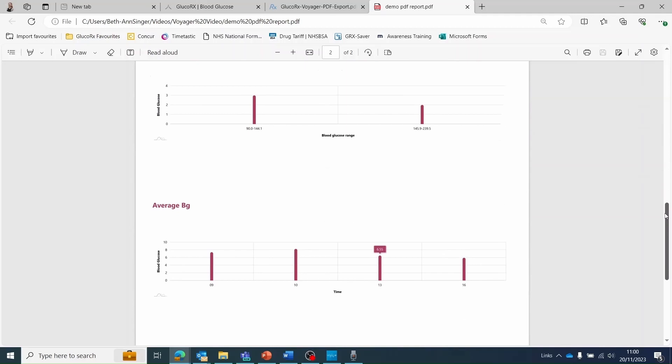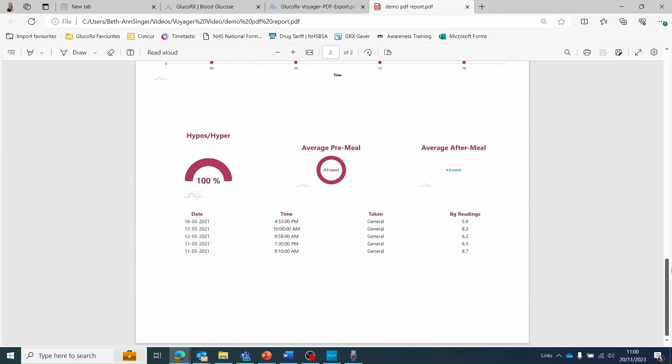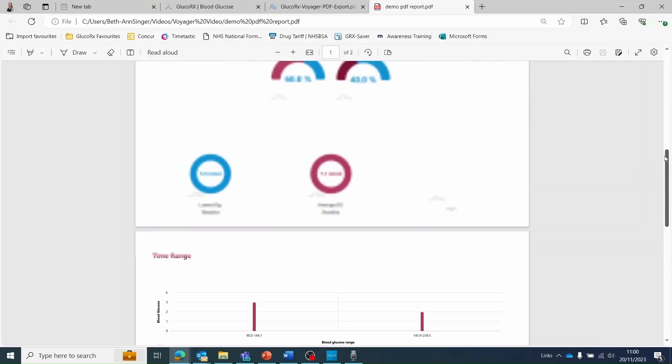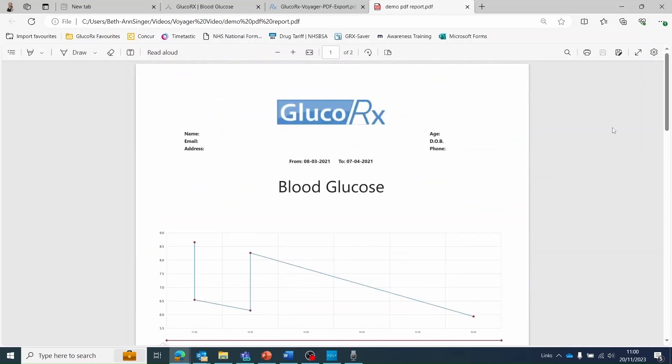This report includes lots of the same information displayed on your GlucoRx Voyager dashboard. You can share this PDF document with your healthcare professional.